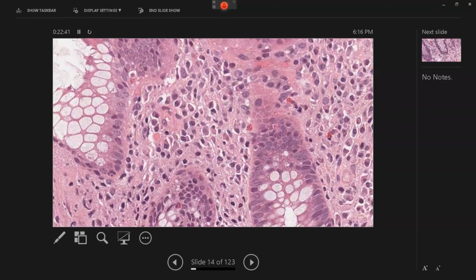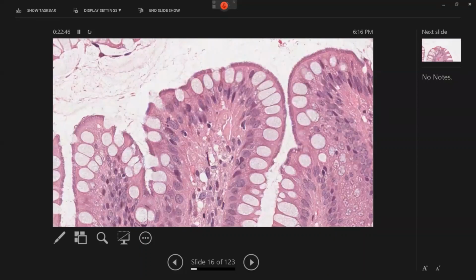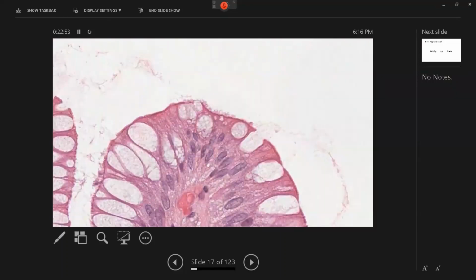You start from the lumen, the surface, and then you find your way downwards. So this is also another example of how you can miss something like this. And this is just a close-up.